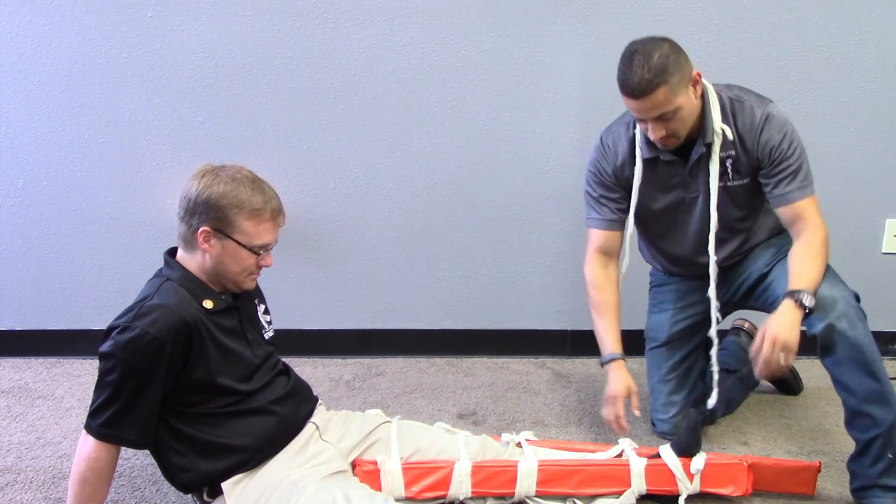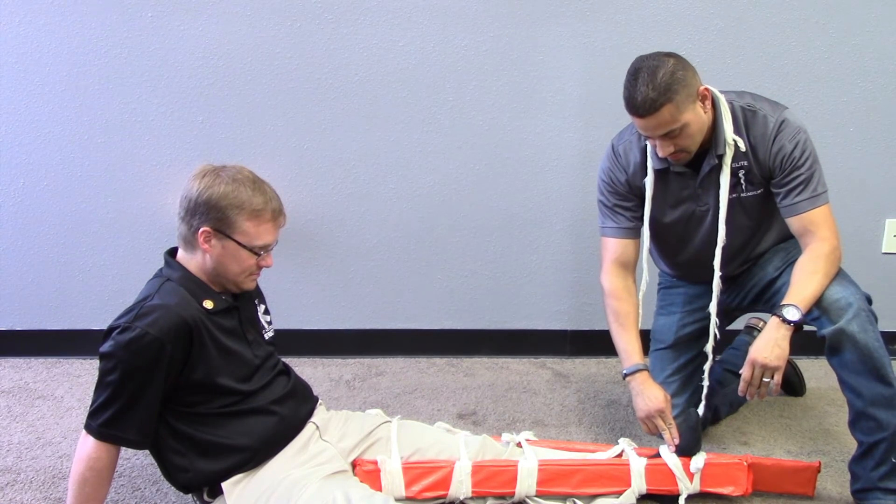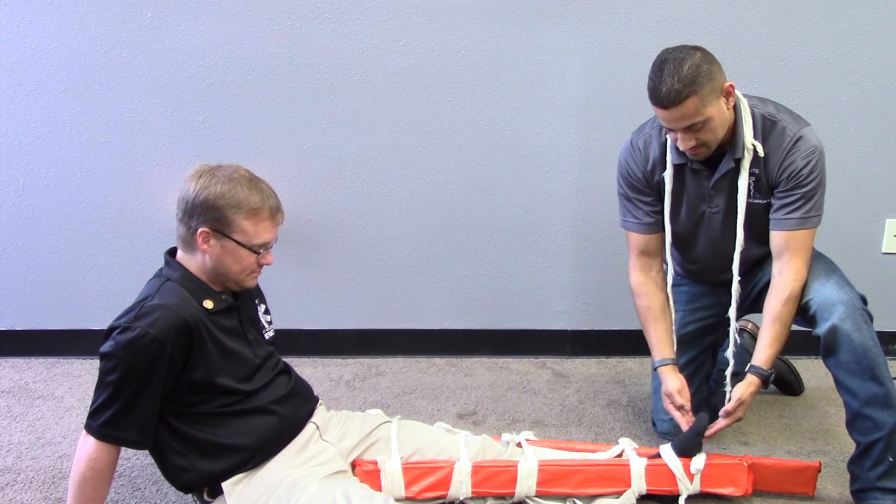Reassess the distal motor, sensory, and circulatory functions in the injured extremity. Feel the pulse? Feel me touching you? Yes sir. Can you wiggle your toes?